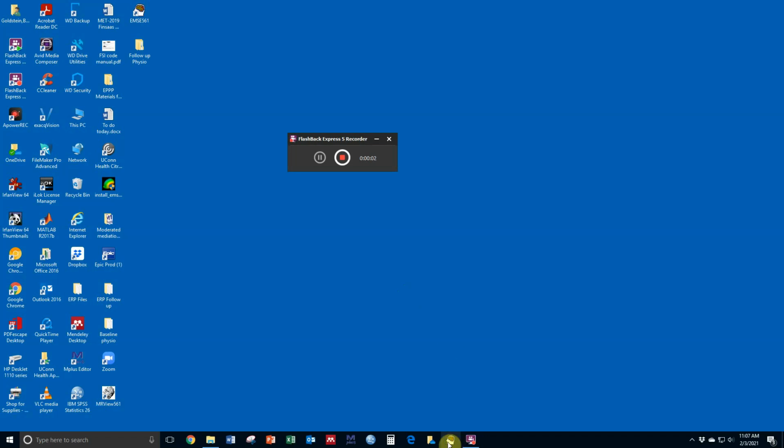All right, we're going to be doing a video to show how to make a workspace in EMSE and then process some heart rate data. Opening up EMSE here.